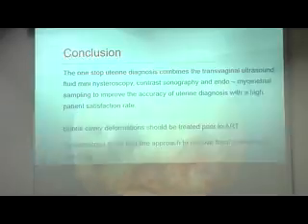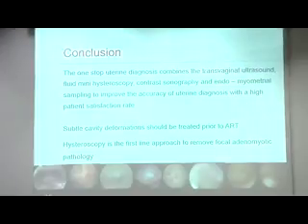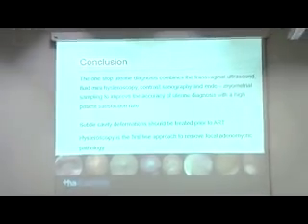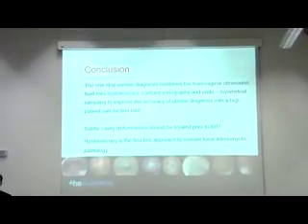So, ladies and gentlemen, I hope you enjoyed the show, but the message is that with hysteroscopy, ultrasound, and anatomopathology in an ambulatory environment, you can give answers which cost a lot of money if you use other instrumentation. It's a new world breaking through. We have to treat the subtle lesions in the uterus, both for the cavity deformation as for those little signs of subendometrial pathology.